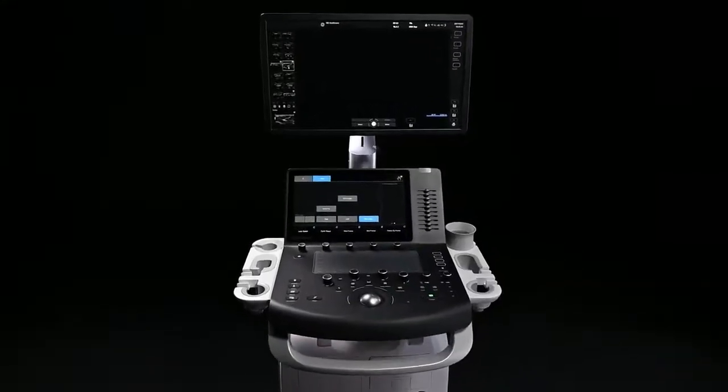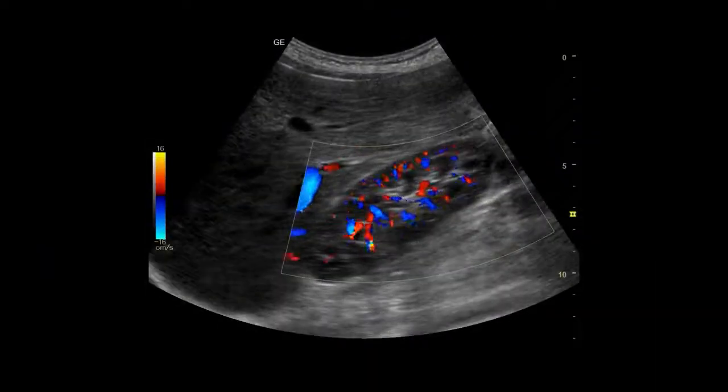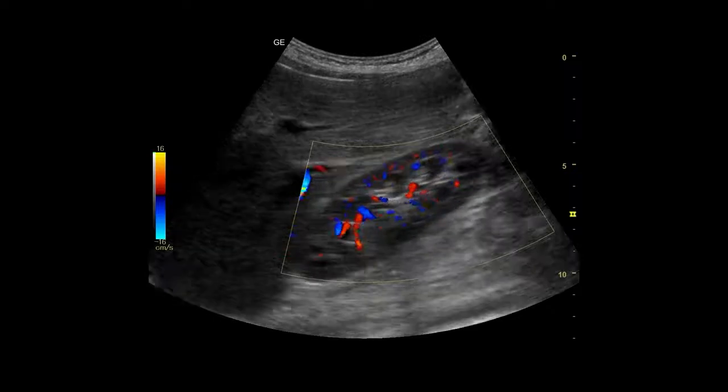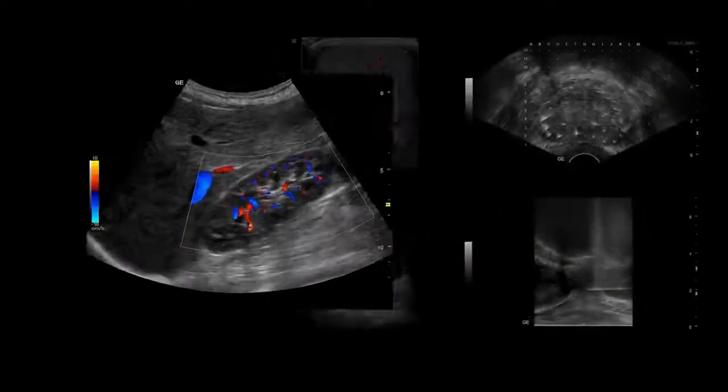Now featuring an updated imaging platform powered by Vision Boost, Versana Premier's enhanced world-class imaging technology helps you see clearly and confidently during urology exams.